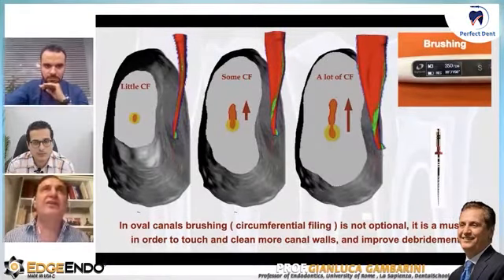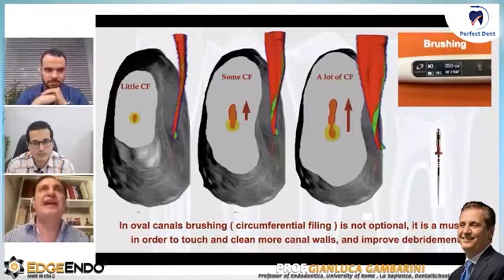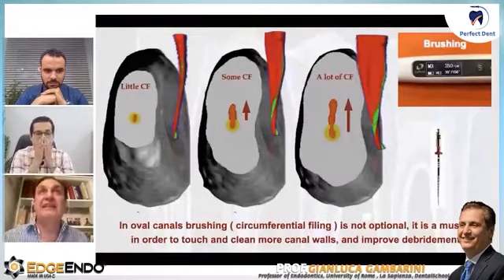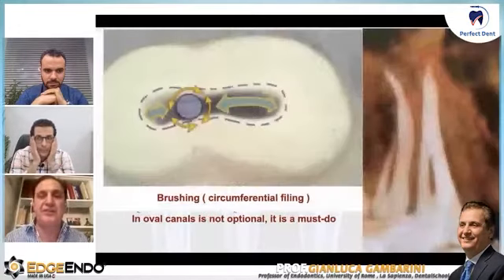We don't need to cut. We need to touch the canal walls. This is for the cleaning, and this is very important. So the amount of brushing depends on the anatomy of the canal, and this is very important that we should understand.